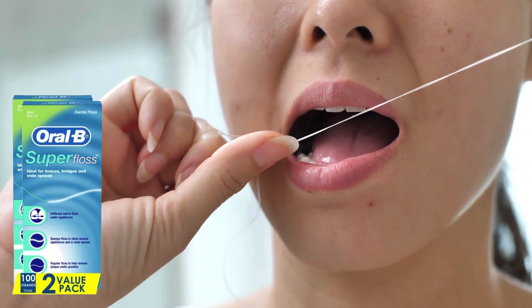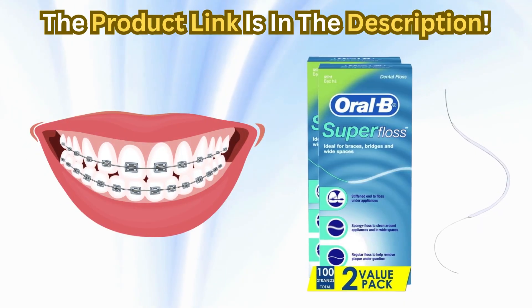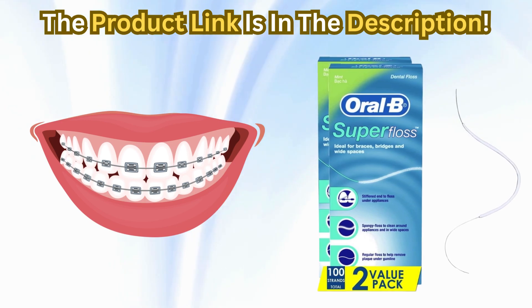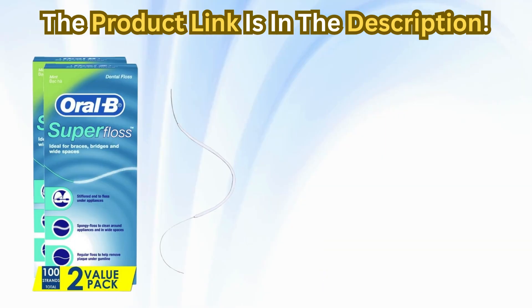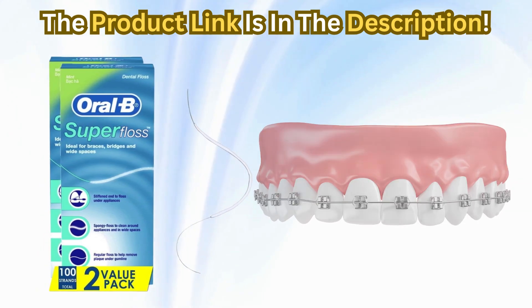From my experience, this floss is a must-have for anyone with braces. It simplifies the flossing process, which can be quite a hassle with braces. The pre-measured strands also mean no guesswork — you get the right amount every time. Compared to regular floss, the Oral-B Super Floss is a clear winner for anyone with braces or wide gaps, and the ease of use and effectiveness in cleaning hard-to-reach areas make it stand out.